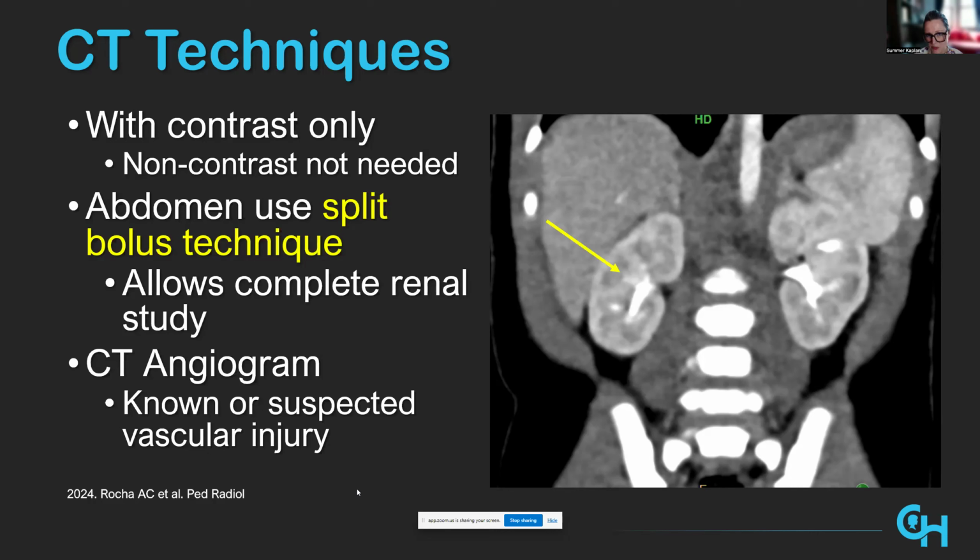Regarding protocols that you might use for CT scanning, those are typically going to be programmed into the machines, ideally. And so having a pediatric trauma abdomen protocol already in the machine is helpful, because then the technologist, whoever's running the scanner, can just select a protocol that's already built in, as opposed to having to make one according to guidelines at the time. Does that answer your question? Yes, thank you.